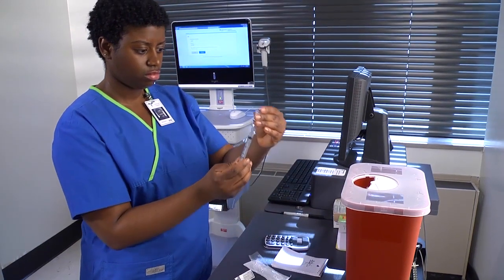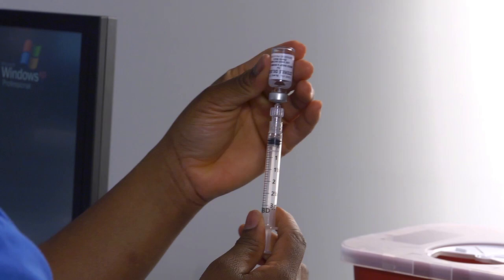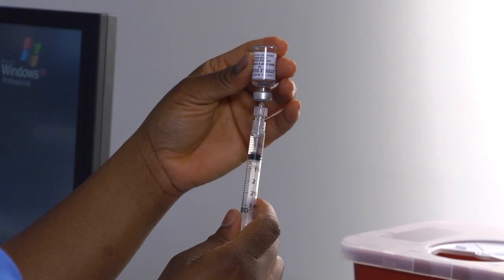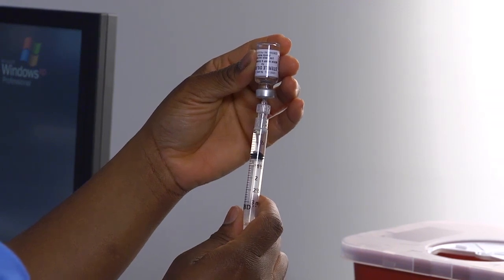Invert the vial, securing the plunger to continue counteracting pressure within the vial. Keeping the tip of the needle or needleless device below the level of the fluid, let the air pressure in the vial slowly force medication into the syringe. You may pull back slightly on the plunger to hasten the process. When the level of medication in the syringe reaches the desired volume, position the tip of the needle or needleless device within the airspace of the vial.